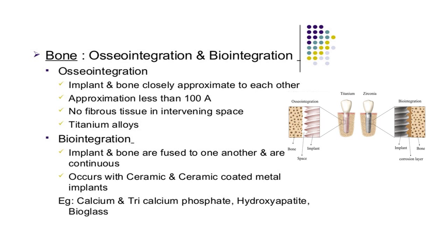By ceramic we mean calcium and tricalcium phosphates, hydroxyapatite, and bioglass. So these are the major differences between osteointegration and biointegration, and are very important. You should be able to appreciate the difference between both of them.